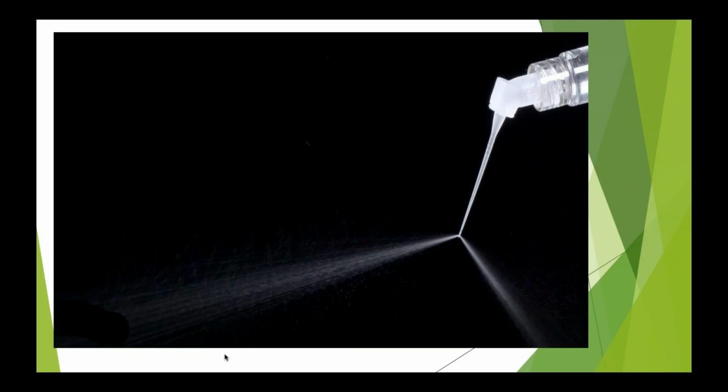And this flexible plastic tip can actually get much deeper into the canal. So I think I'm really getting my solutions much deeper. But you'll probably run into this, and so you just need to be aware of it. But this is where a lot of the irrigation is starting to flow, is this Irriflex tip.